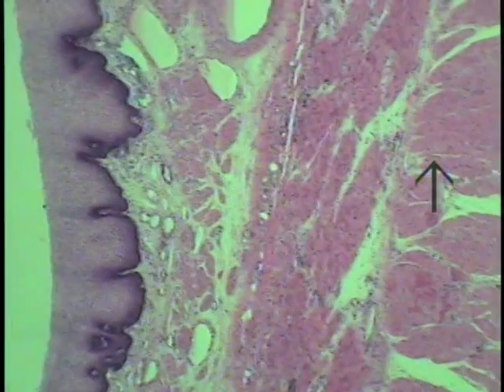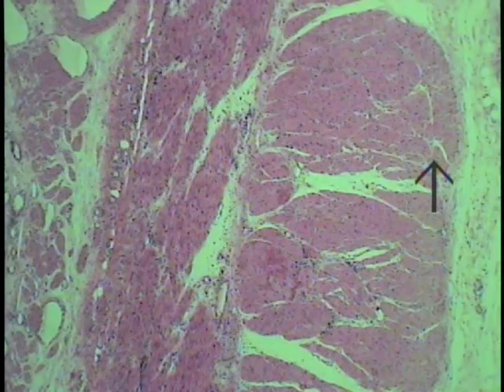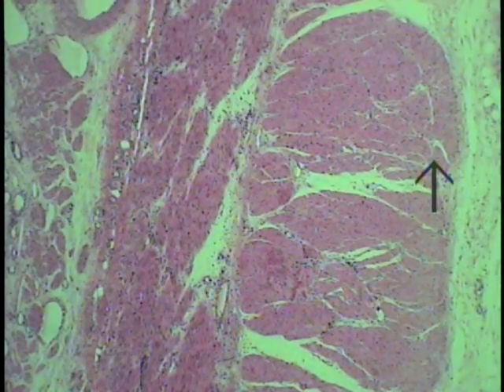It should be remembered that when examining the muscularis externa of the esophagus, as shown here, which forms the most substantial portion of the esophageal wall, the upper one quarter of the muscularis externa consists of skeletal muscle only. It receives fibers from the inferior constrictor muscle of the pharynx, and then the muscle becomes progressively more regularly arranged into circular and outer longitudinal layers from that point of origin. In the second one quarter of the human esophagus, a mixture of skeletal and smooth muscle will be found, while in the distal half, only smooth muscle will be present.